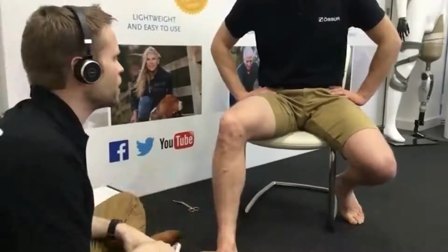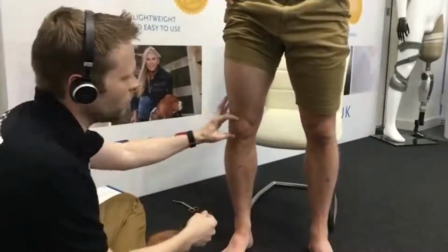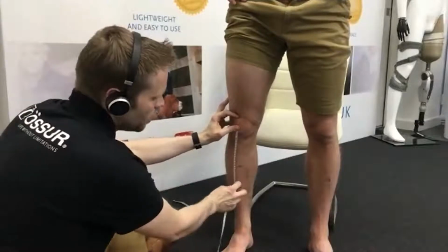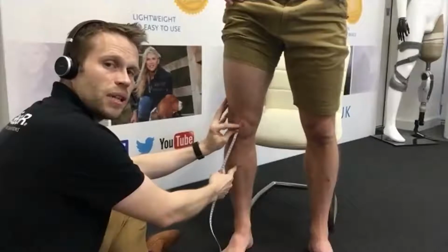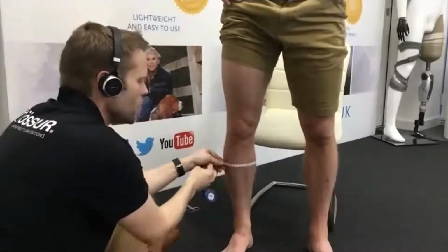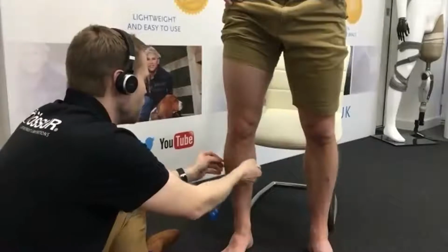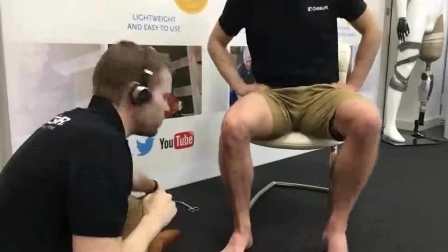So we start with the leg straight. So in this case, we'll get you to stand up, Pete. And we're going to find mid-patella. We're placing the tape measure at the center of mid-patella, passing the tape measure down, and we want to measure at 15 centimeters below mid-patella. So we're passing the tape measure round, taking our measurement, and in the case of Pete, this comes in at about 38, okay? And then we compare this to a sizing chart and then fit the correct brace.